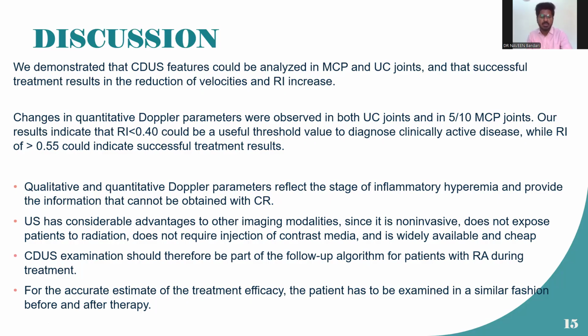The color Doppler ultrasound examination should therefore be a part of the follow-up algorithm of patients with rheumatoid arthritis during the treatment. And for accurate estimate of the treatment efficacy, the patient has to be examined in a similar fashion before and also after the treatment.